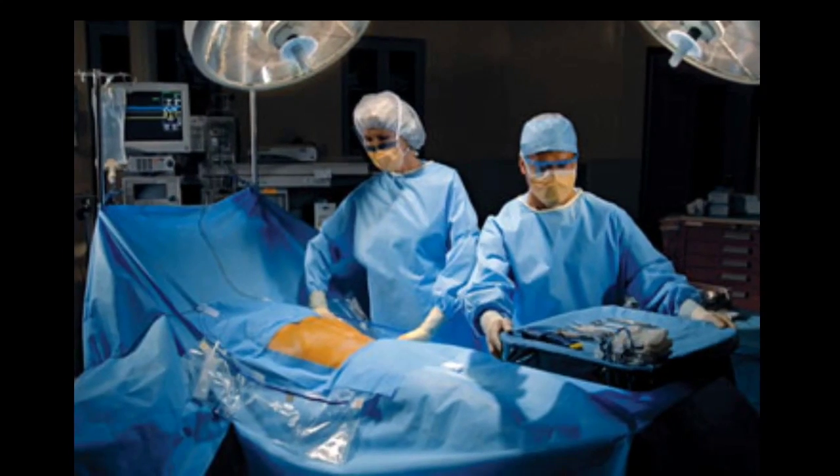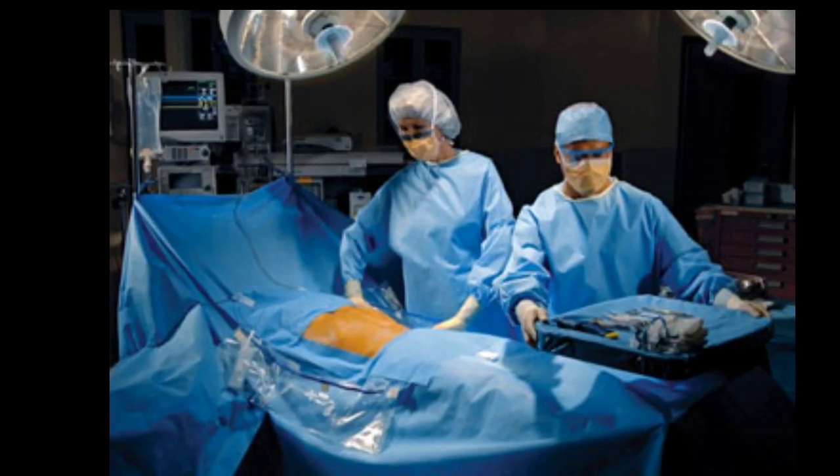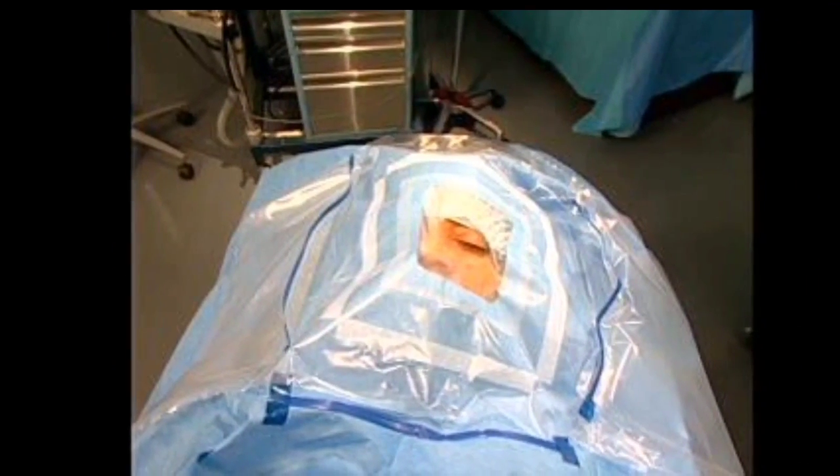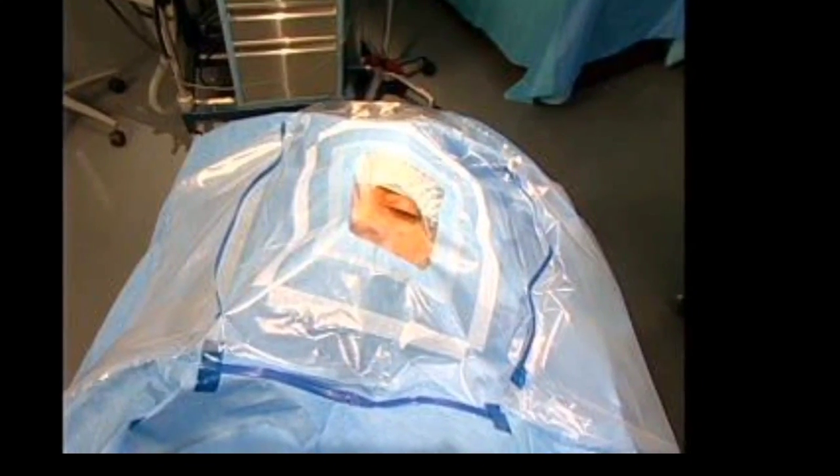Another easy way to prevent static electricity is to drape it and leave it. Once an area is draped for surgery, the drapes should be left alone. This is done not only to protect the sterility of the drape, but the unnecessary rubbing together of drapes can also start a fire.